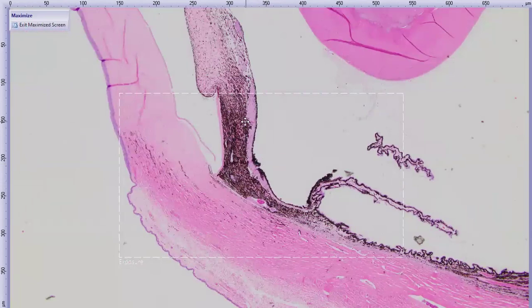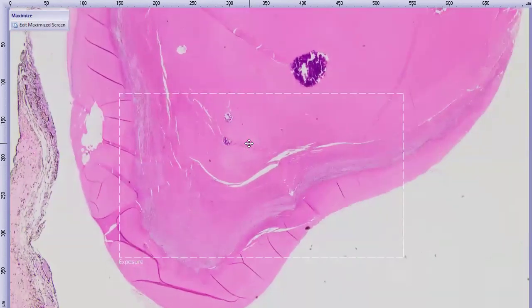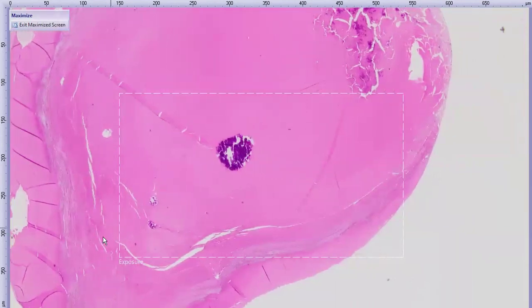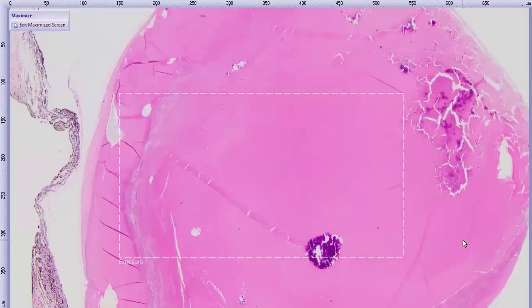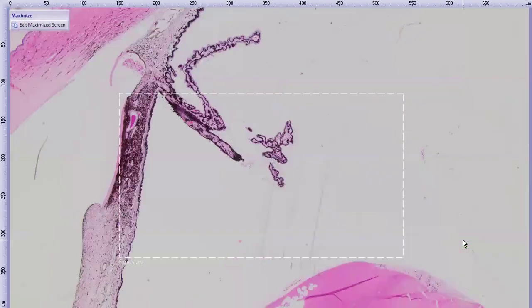And we have a similar situation over here where we have a very darkly pigmented iris stroma, and we have this dark pink band of stuff on the peripheral iris. The lens fibers are degenerating, and here's some accumulation of mineral. The center of the lens, or the nucleus, is also affected in addition to the cortex or the periphery of the lens. And so this is a cataract. So hypermature, probably cataract.